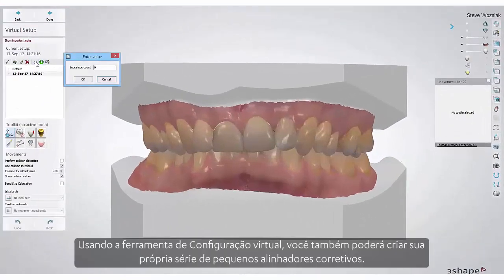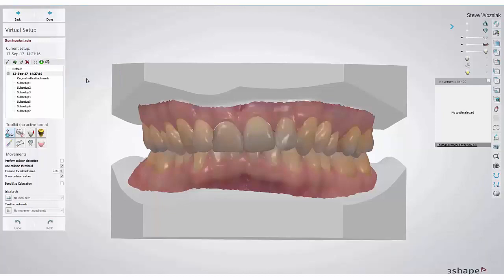Using the virtual setup tool, you are able to create your own series of small corrective aligners.